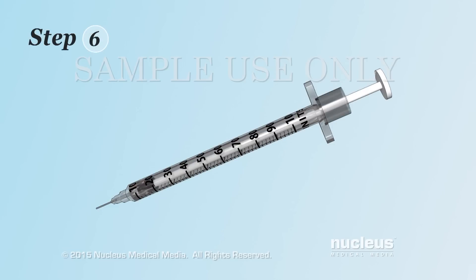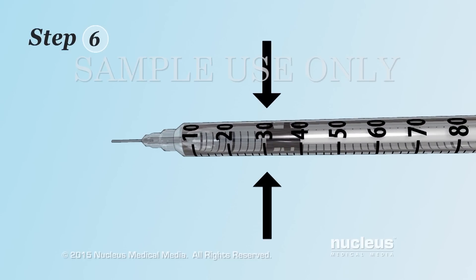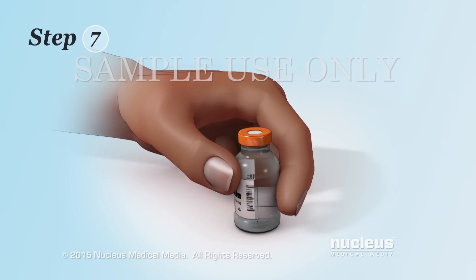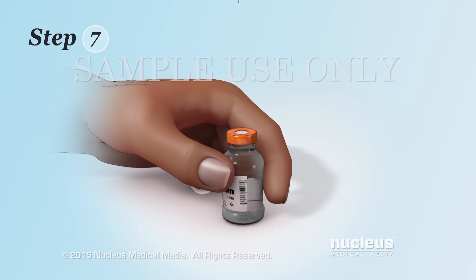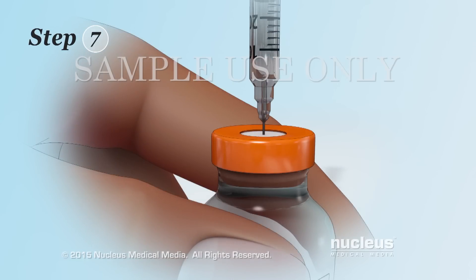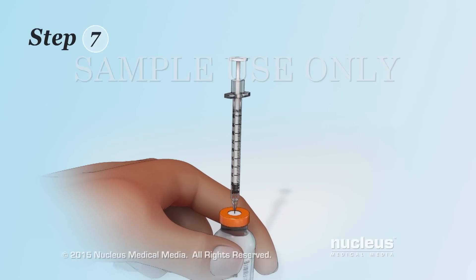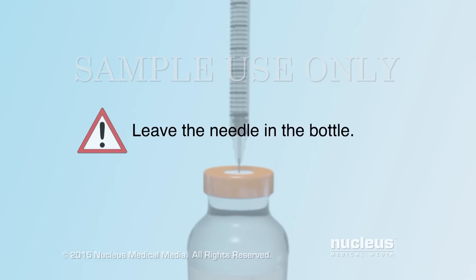Step 6: Pull back the plunger to draw in an amount of air that is equal to your insulin dose. Step 7: Hold your insulin bottle securely on a flat surface. Push the needle through the rubber on the top of the bottle. Push the plunger to inject the air into the insulin bottle. Leave the needle in the bottle. This helps to keep the right amount of pressure in the bottle and makes it easier to draw insulin into the syringe.